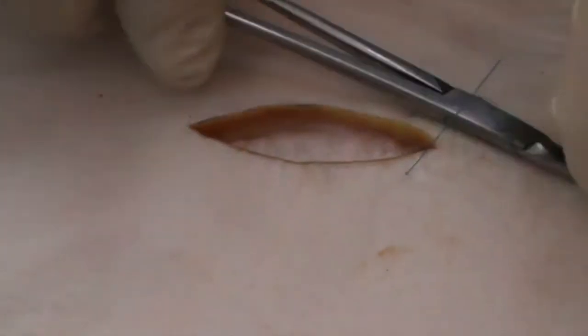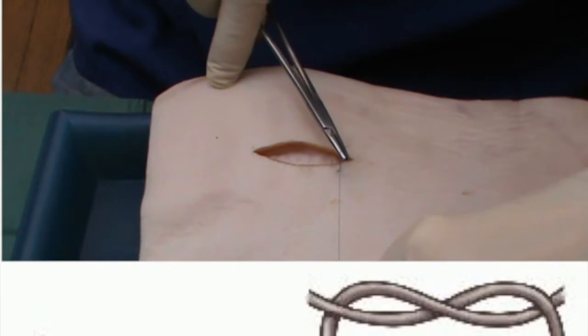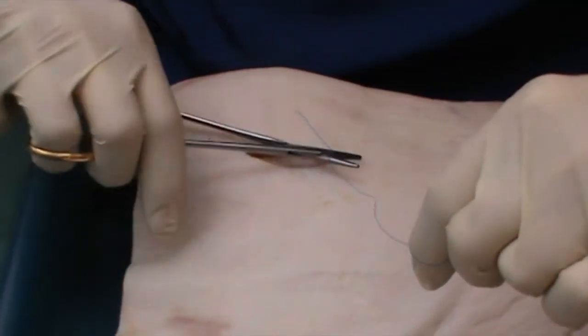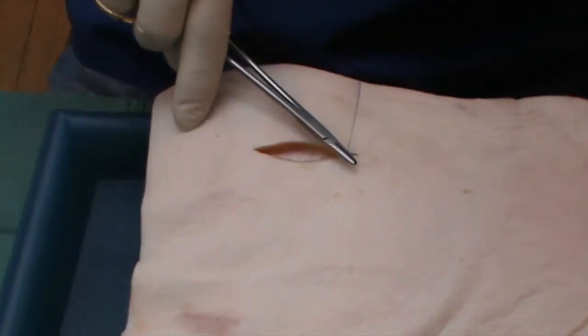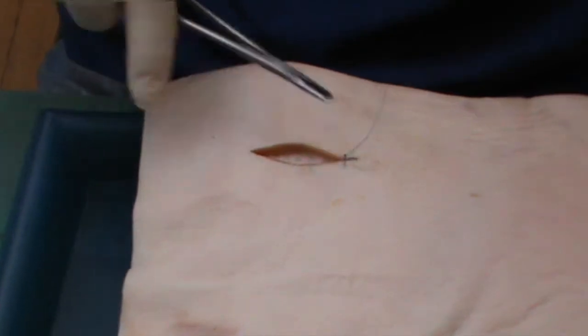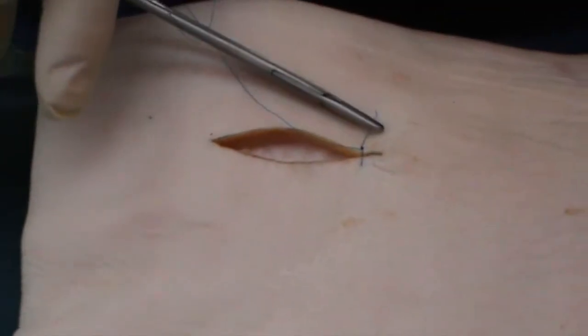As far as tying is concerned, a lot of people tend to tie down here and they end up with great awkwardness. Instead, tie your knot some distance from the skin and then when you come to draw this together, allow the knot to be brought down to the skin in this way. So here you have the skin brought together and then if you bring this edge across and hold the other suture end — the needle end the other way — you have it locked. A second knot in the opposite direction and then the original direction.